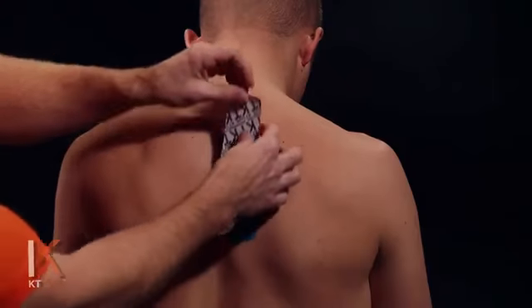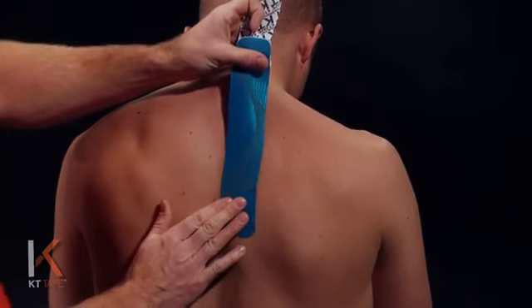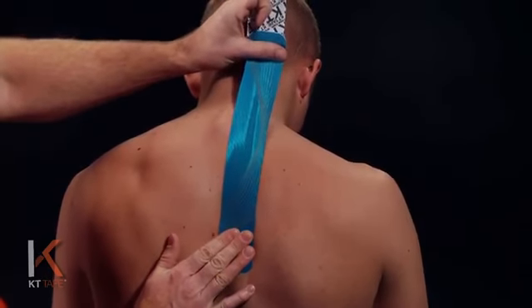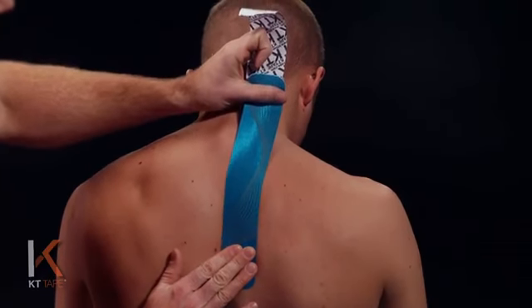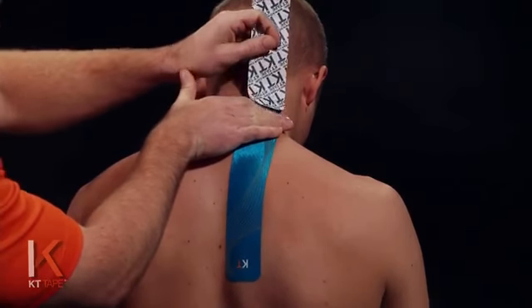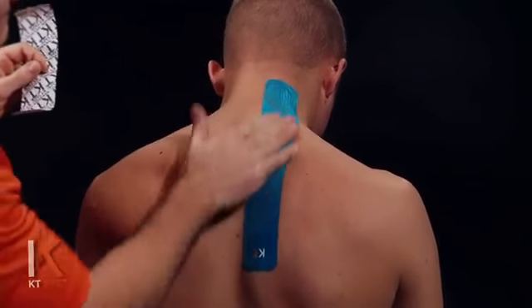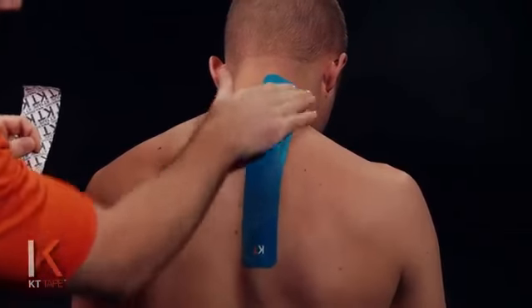Okay, and to apply this, I'm going to take that backing paper off, leaving a little bit of paper on there so I can handle the tape without touching the adhesive. And I'm going to stretch this nice and evenly with 25% stretch. So if that's 100%, I'm going to back that off 50% and 50% again. And I'm going to lay that down, except for the last little bit, I'm going to just let that end of the tape fall onto the skin. Okay, with absolutely zero stretch.